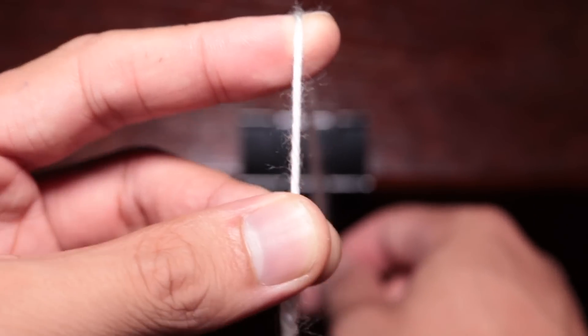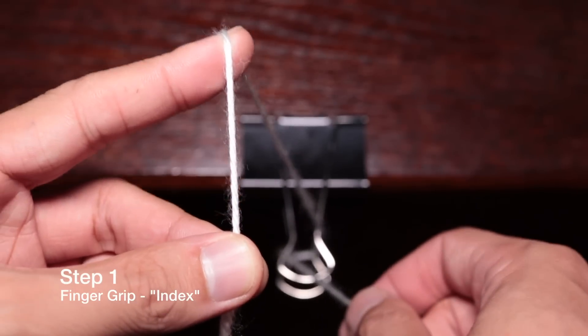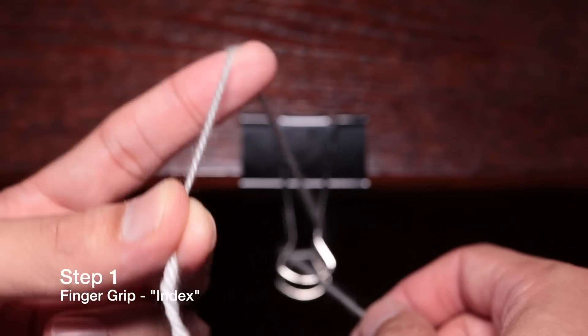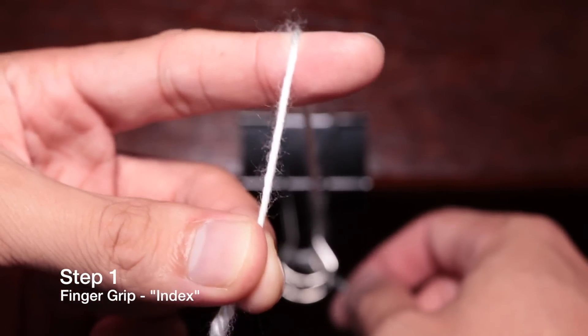This is going to be the grip: holding the string in between the middle finger and the thumb and then the index finger just underneath it making some tension like that. This is the first type of knot out of two.